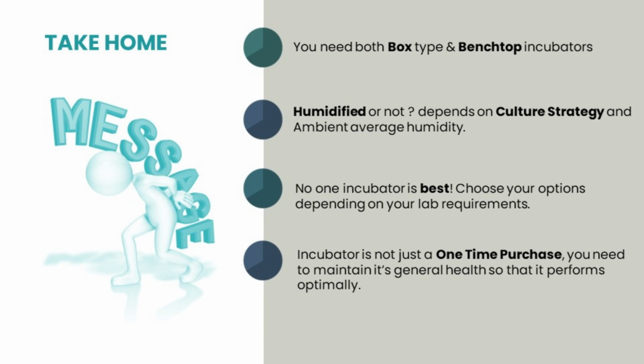So the take-home message from this session: I think the first take-home message is that you need both box type and benchtop incubators. Benchtop is not optional.